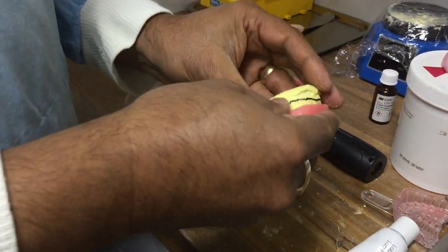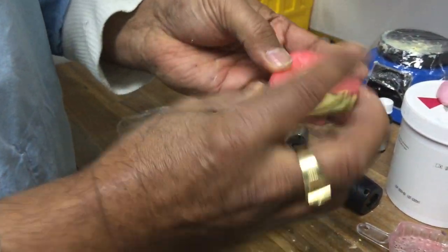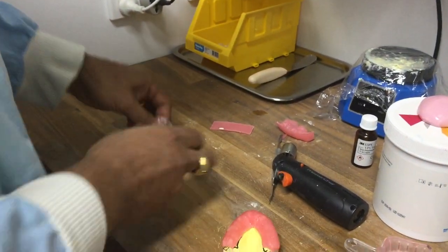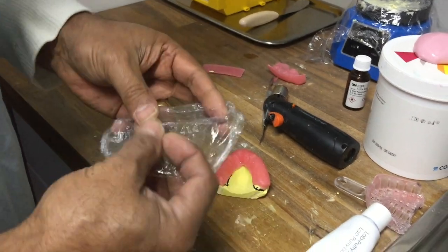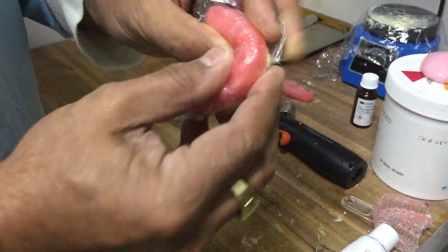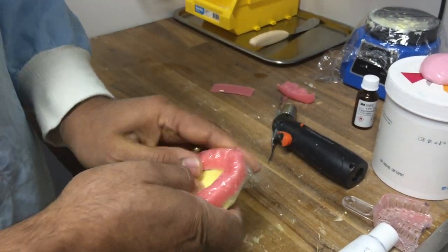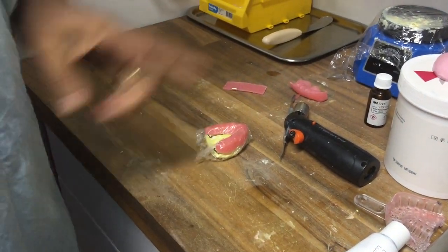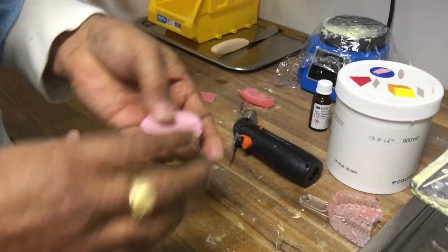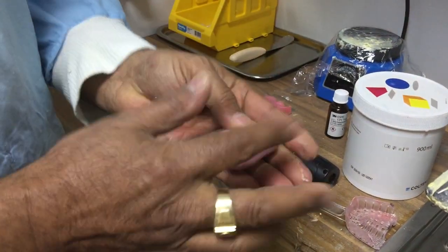Here's one I made earlier. I'll put it back on and trim it to about where I want it. Ideally we should have foil for this, but unfortunately we've run out, so I'm just using a bit of glad wrap like that. That's going to make sure the wax doesn't contaminate anything.